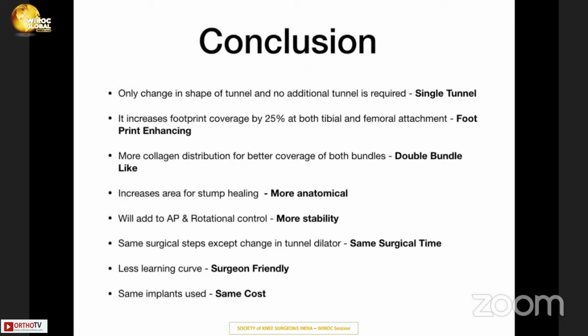Same surgical steps except for the change in tunnel dilator. So same surgical time, less learning curve, surgeon friendly, and you can use the same implants. Hence, it's the same cost.